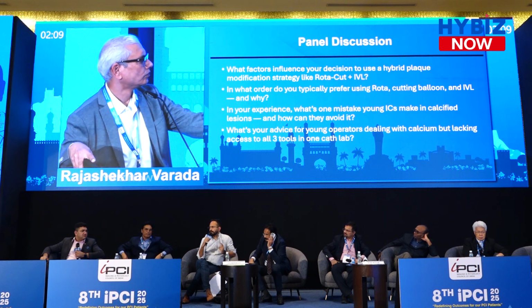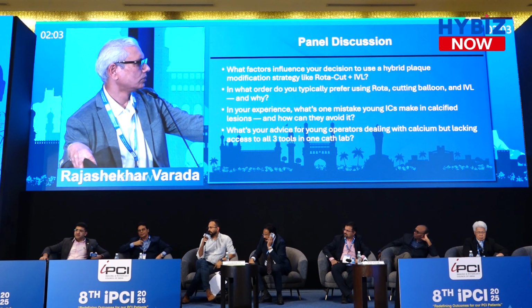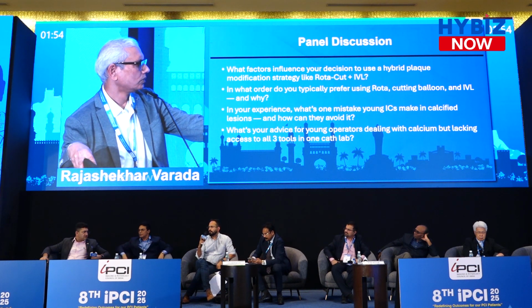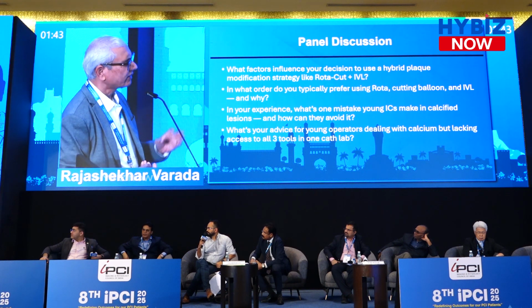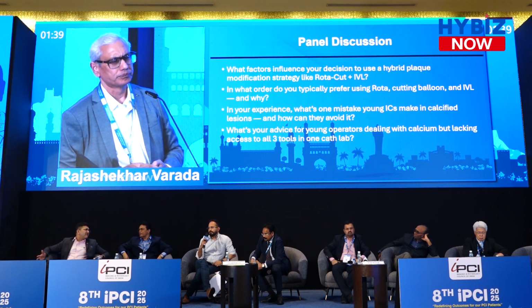The most important thing is delamination of the stent, loss of drug, loss of polymer, polymer breakage. The drug kinetics get disturbed. So this is what is important. Going from 2.75 to 5, you can have one cross-link fracture or something. It's not causing an event, but the drug loss will cause restenosis. It's important that the stent must have a bench test. Nagomi has a lot of bench testing. This is one important thing.